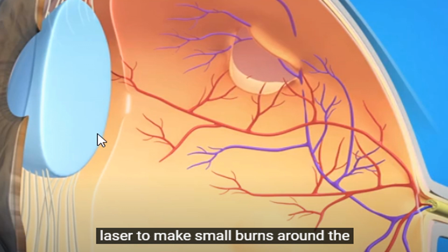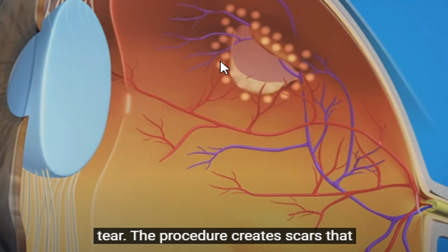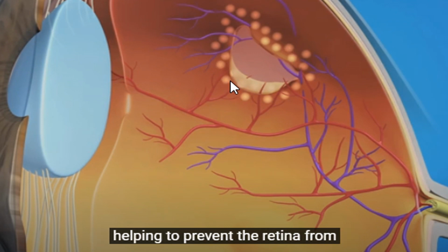Okay, so here let's start with photocoagulation. We have two rows of laser, actually an argon laser around the tear. I prefer two rows; I don't consider one row a perfect photocoagulation. If you ask me why, Dr. Sharif, are we making these two rows? For two reasons. First of all, we are burning the retina around it. This is healthy retina where we are shooting. Why are we shooting healthy retina? It's okay if we shoot a small area that the patient may not notice.